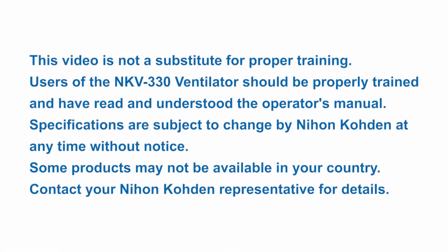This video is not a substitute for proper training. Users of the NKV-330 ventilator should be properly trained and have read and understood the operator's manual. Specifications are subject to change by Nihon Kohden at any time without notice. Some products may not be available in your country. Contact your Nihon Kohden representative for details.